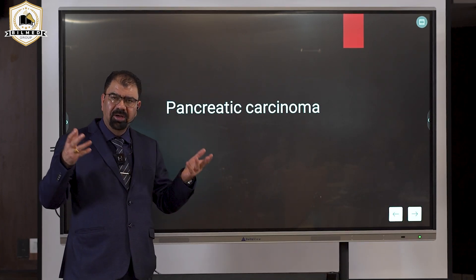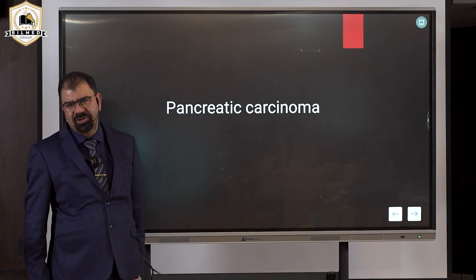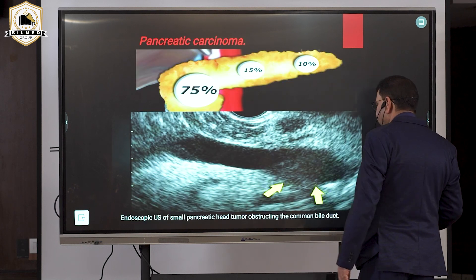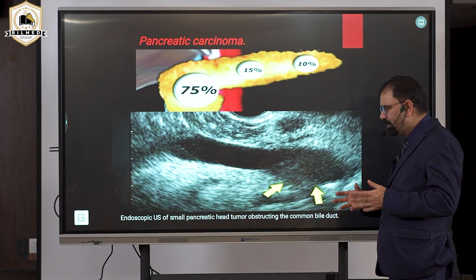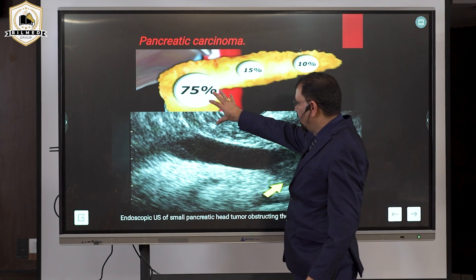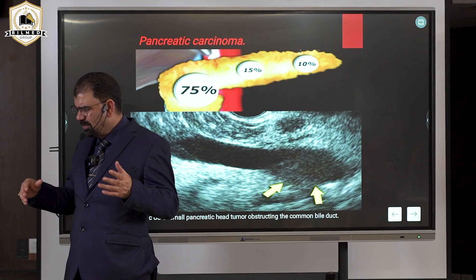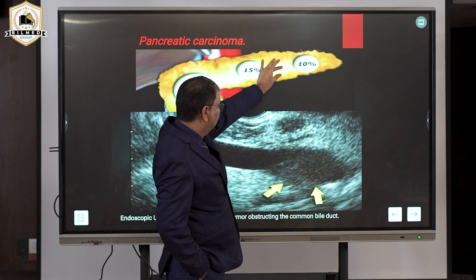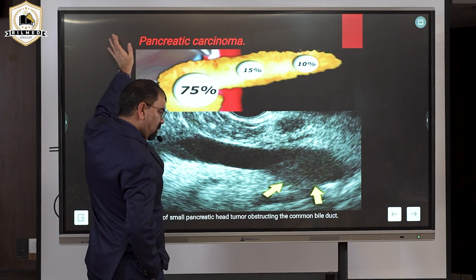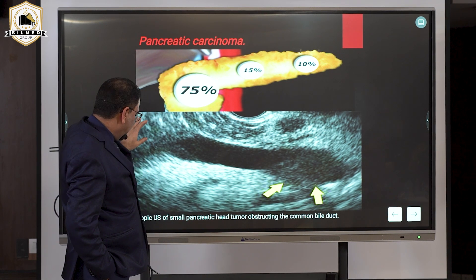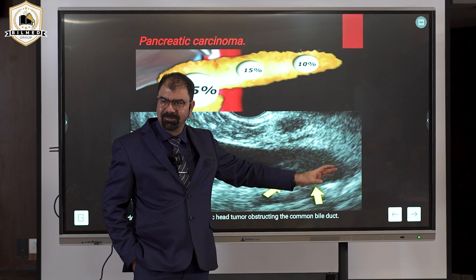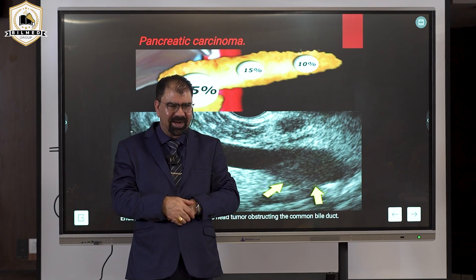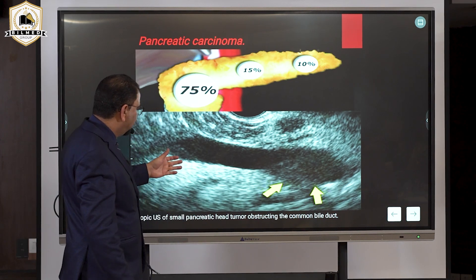Think through the anatomy — don't just copy and paste pictures. The important point is: 70 to 90 percent of pancreatic carcinomas are in the head. What will happen to the pancreatic duct? It will dilate. The above structures will look abnormal. If I take the inferior vena cava in length, I will see the mass sitting on top of the IVC because of the anatomical relationship in long-axis section.